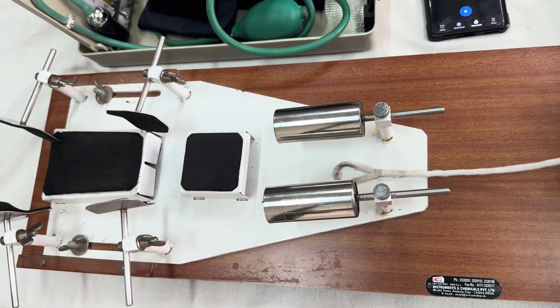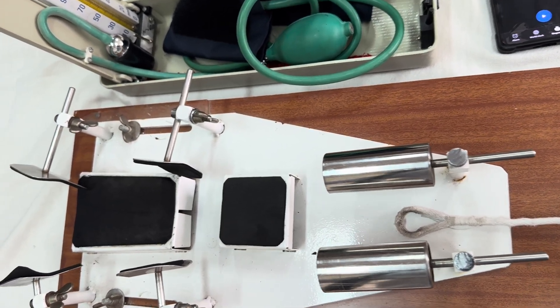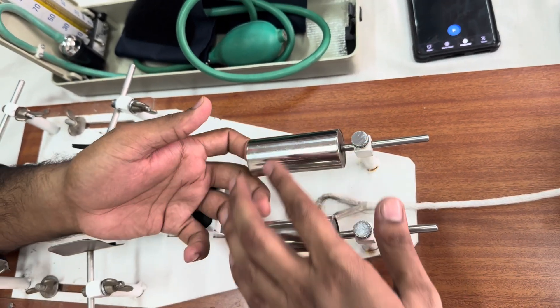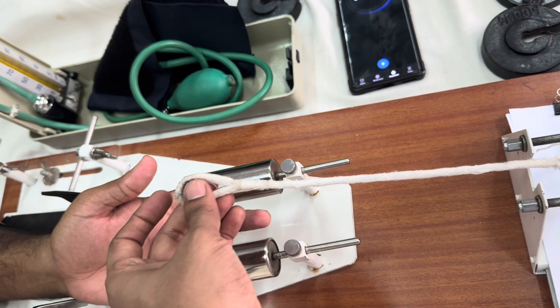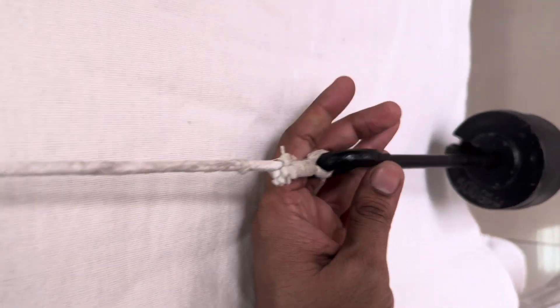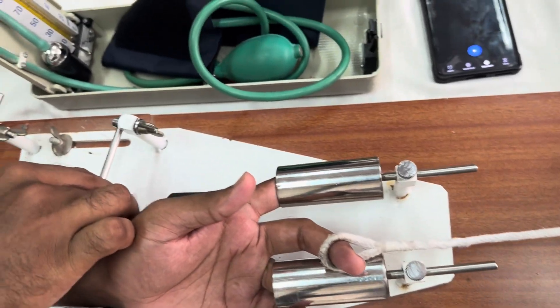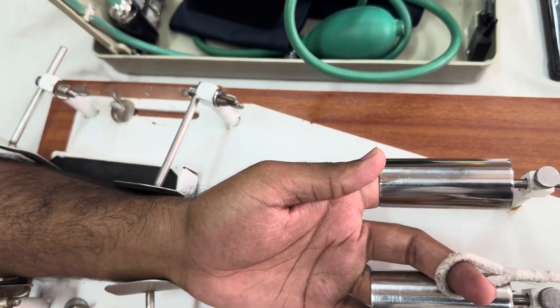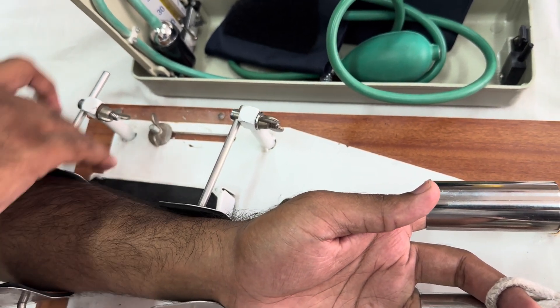Let us discuss the parts of the instrument. The Mosso's Ergograph consists of clamps for keeping the forearm and metallic cylinders or finger holders for keeping the index finger and the ring finger. There is a string or rope attached here, with the other end passed over a pulley over which the weight is placed. We have put a total of 2 kg. You can adjust according to the strength of the subject. The clamp should not be too tightly fixed so as to block the blood vessels.